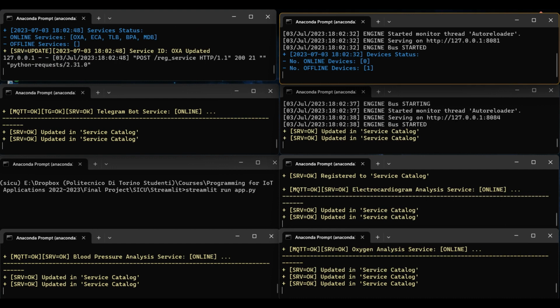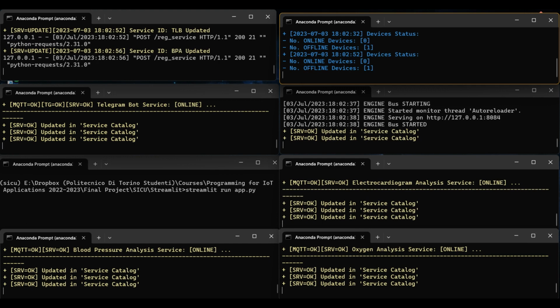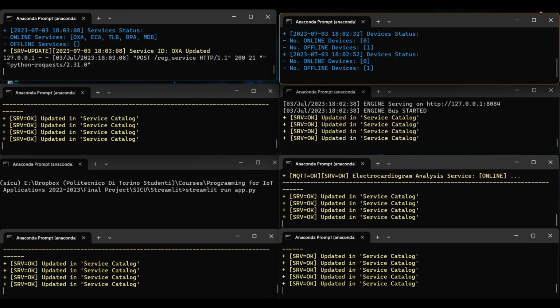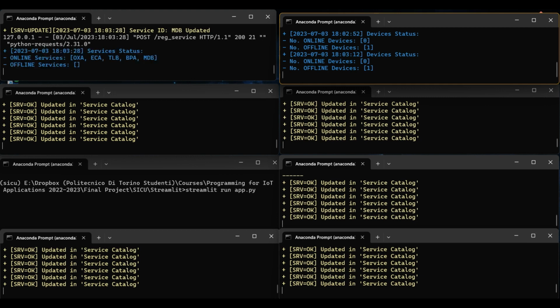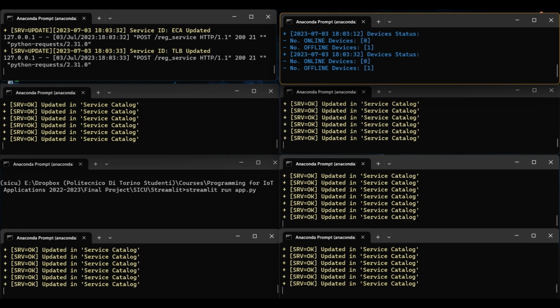And also on the service catalog side, it starts to check the status of the microservices in a specific period of time, and if a service didn't send an update request, it will be removed from the currently active services. The same process applies to the device catalog, in which the devices register themselves into the device registry system, and if a device couldn't send the update request to the device catalog, the device catalog thinks that the device is out of order and considers it an offline device.